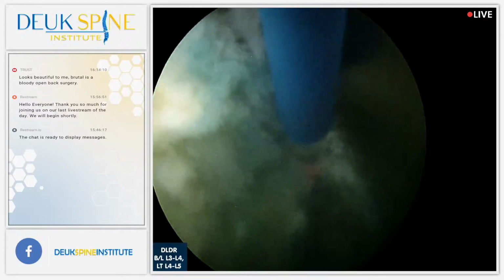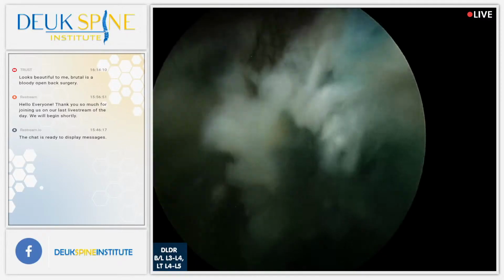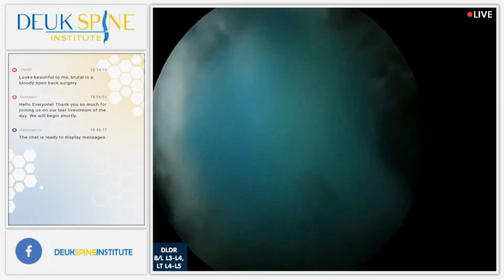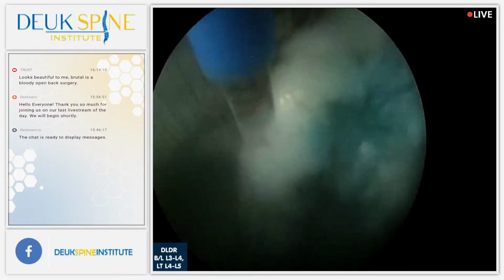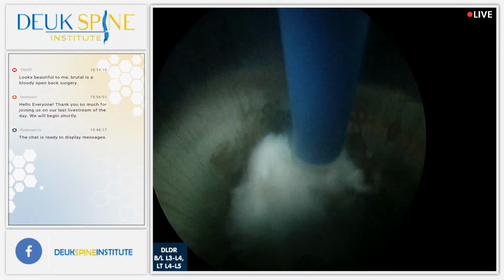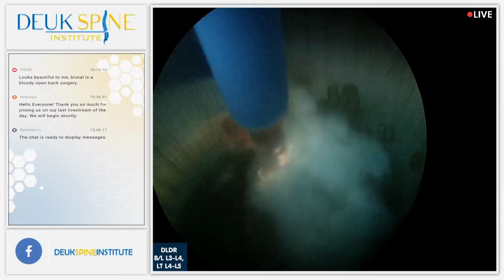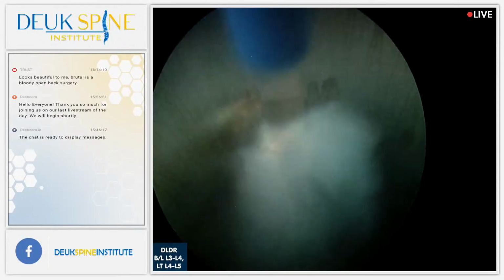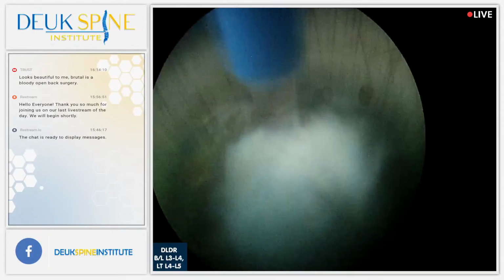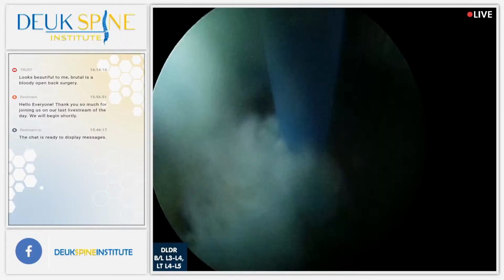But you're right, most doctors that do open back surgery get into a situation where there's the tear right there. You guys see it? They get into a situation where they have to transfuse the patient because of too much blood loss. It's weird because a lot of spine surgeons don't think it's their responsibility to help control bleeding. They think it's the anesthesiologist's job to manage the hematocrit.